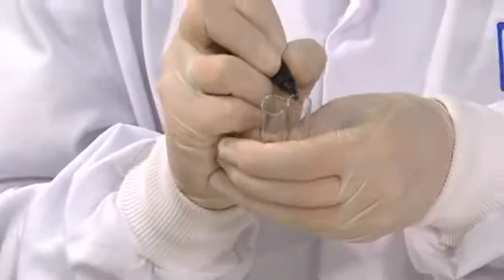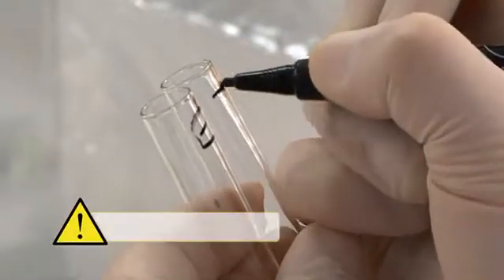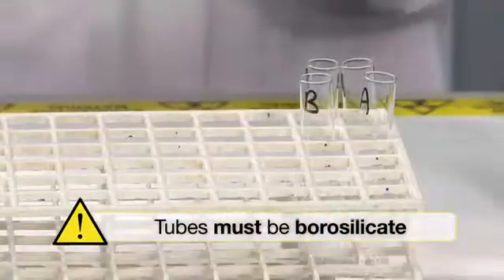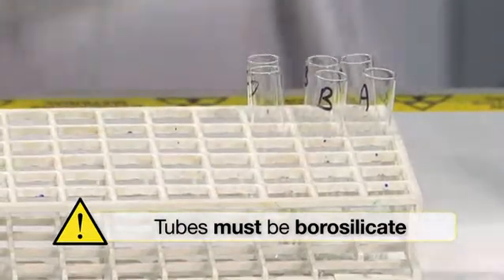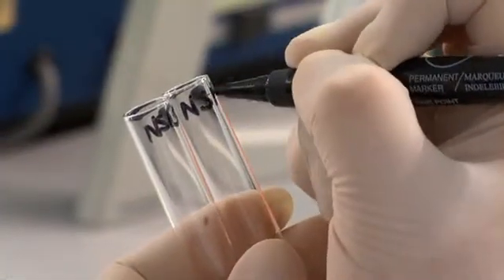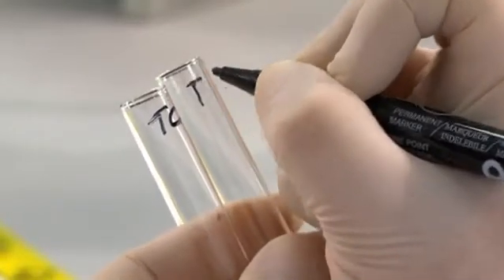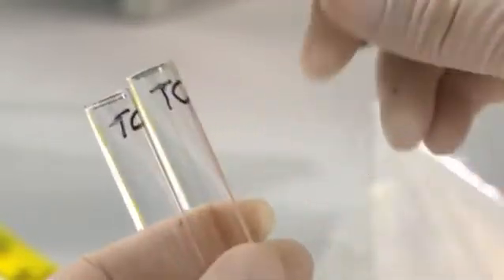While waiting, prepare labeled borosilicate glass tubes, one for each calibrator, two as non-specific binding NSB tubes, and two as total count TC tubes.